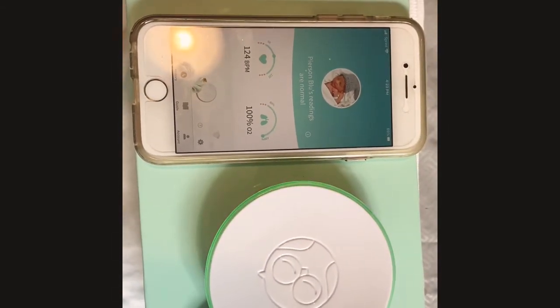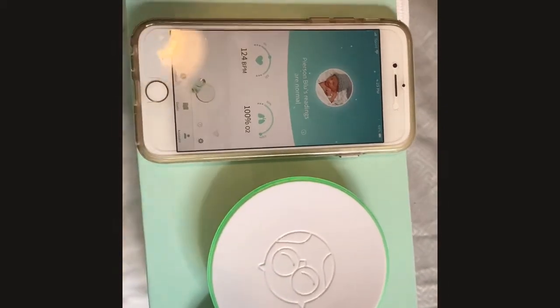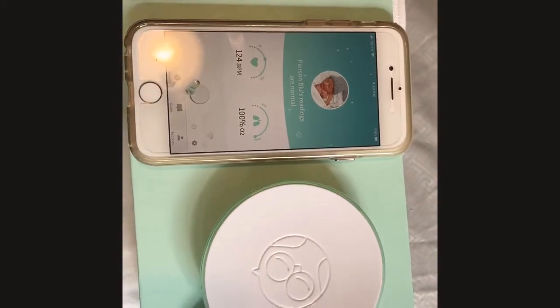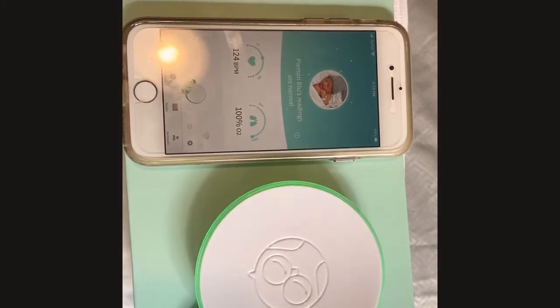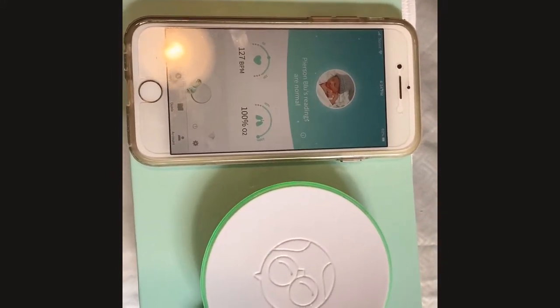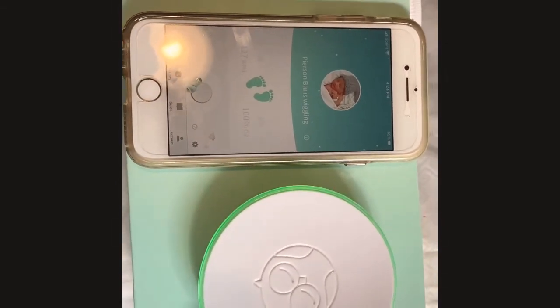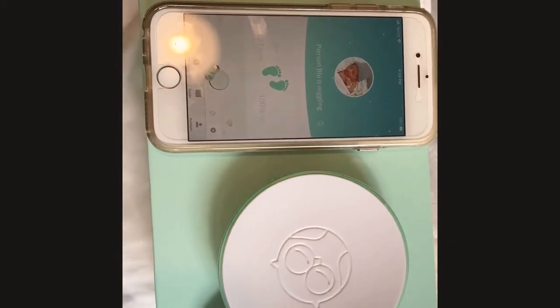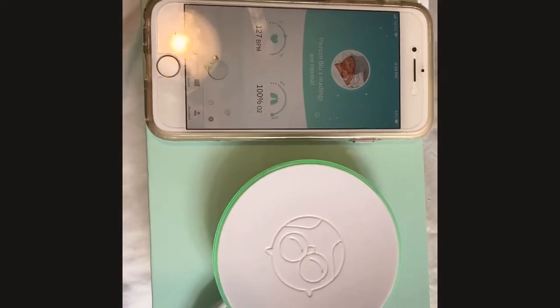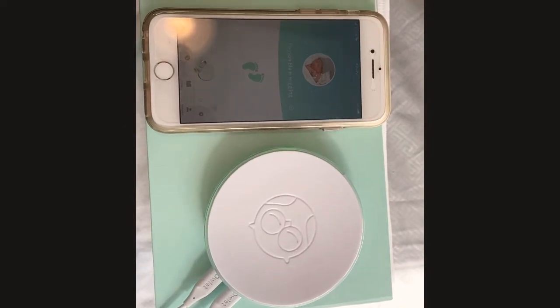This is a really great device for peace of mind and safe sleep. Also, if your baby has a cold, you can track their oxygen level. I know that's the first thing they want to check when you take them into the pediatrician, so it's always good to be able to let them know if you see any drops in oxygen.